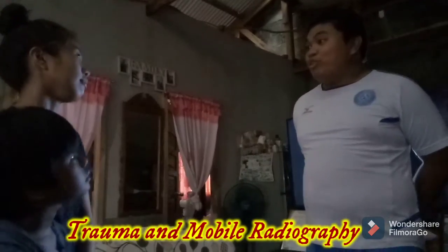Good afternoon, ma'am. I am your radiologic technologist for today, and I am JONALD ICOY. Ma'am, what is the patient's name? What is the birthday, ma'am? January 14. Ma'am, is our procedure a chest x-ray? Okay. Ma'am, please remove the metallic objects, the jewelry. And here is the patient's gown, ma'am. The opening of the patient gown is at the back, not the front. I can assist you, ma'am, if you like.